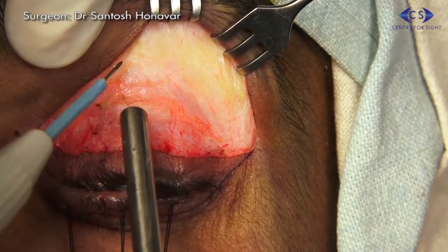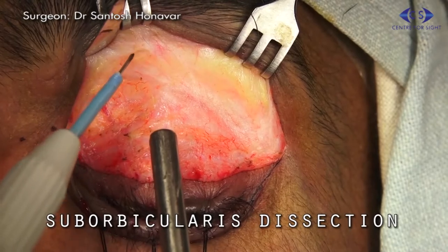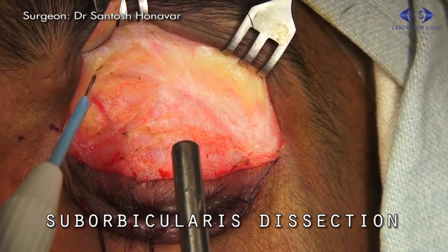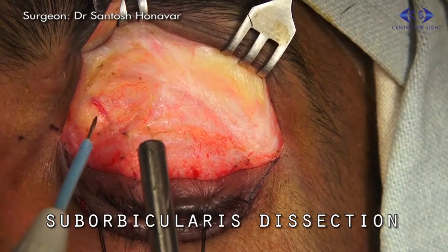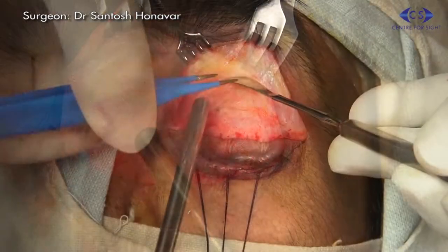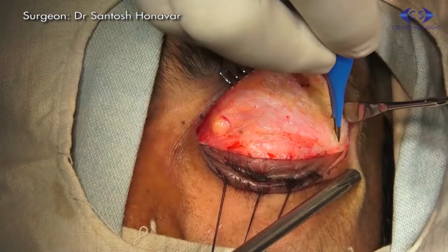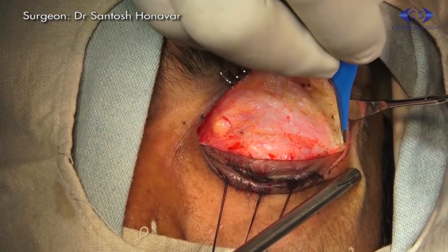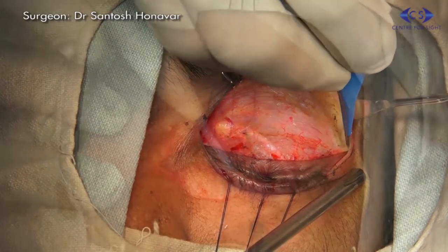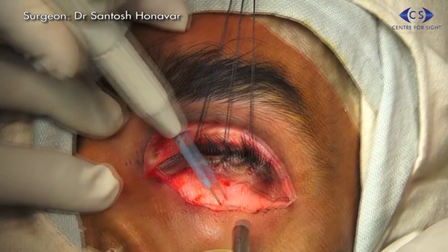This also spares the orbicularis muscle, which provides an excellent vascular supply to the skin flap.